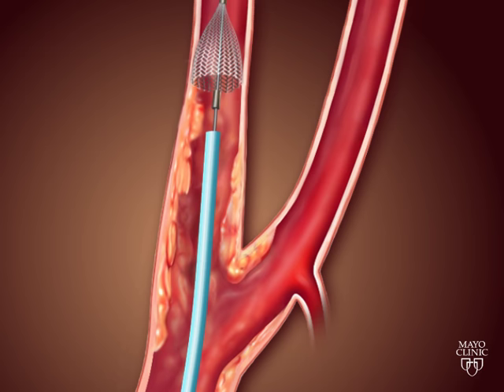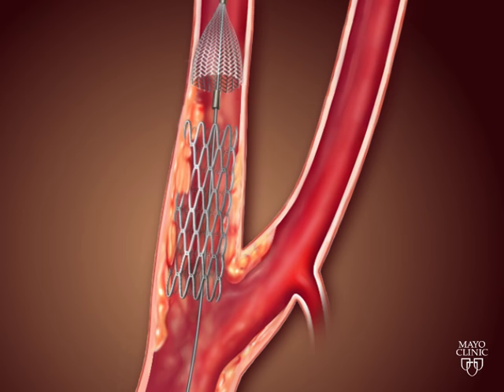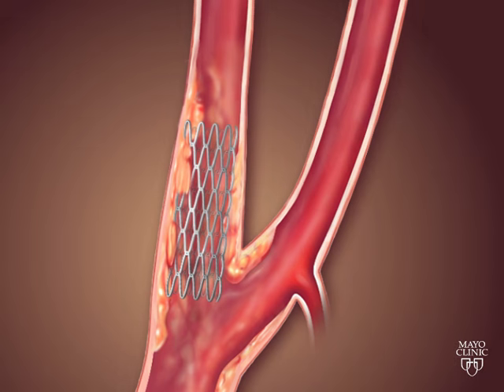A small metal coil called a stent is inserted into the vessel. The stent serves as a scaffold to help prevent the artery from narrowing again.